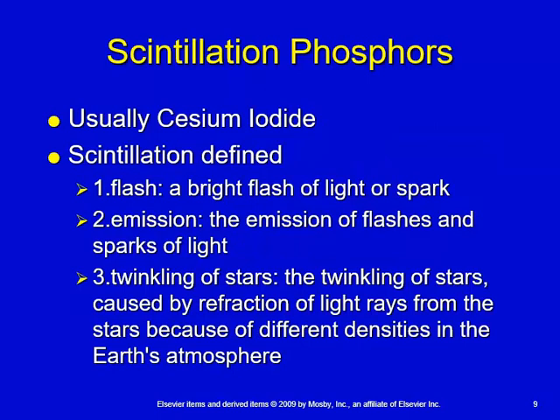So hopefully to help you remember what scintillation means: the definitions of scintillation are a bright flash or a spark, the emission of flashes or sparks of light, kind of like the twinkling of the stars.